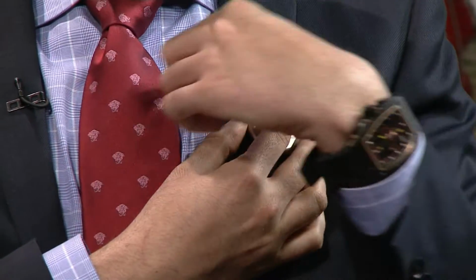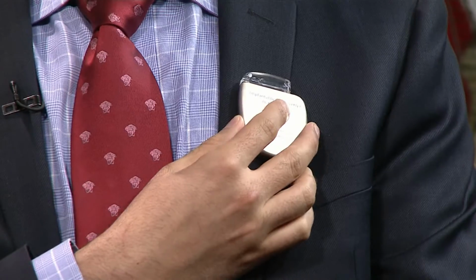This is the defibrillator. It's a little larger than the pacemaker. We also implant it here, and then the wires go into the heart. When the patient has a very fast heart rate, this device delivers a shock that brings the heart back to its normal rhythm again. Kicks it back into pace. Kicks it back into pace. All right, so those are some things to correct problems.